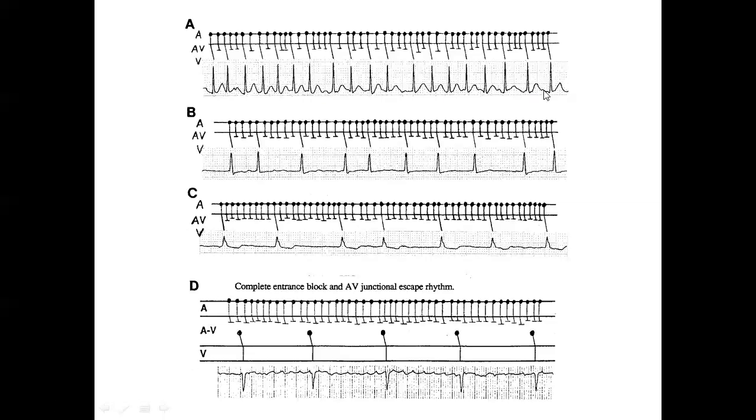No, it's atrial fib because there's no flutter waves. You might call it fib flutter, but if it is a flutter, it is not flutter conducting at, say, 10-to-1 or 8-to-1. If so, what appears to be flutter and the QRS should maintain a fixed relationship. They don't. So it is not atrial flutter with a fixed slow conduction ratio, but just the atrial fib continuing, and complete entrance block and junction escaping, and a rather serious situation now.